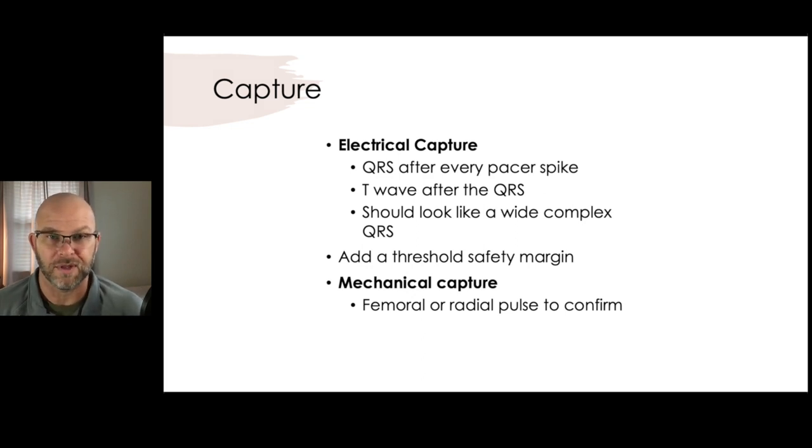We want to make sure we have capture. There are two forms: electrical capture and mechanical capture — mechanical capture matters more. Electrical capture means you have a QRS after every pacer spike, and more importantly, you want a T-wave, which helps differentiate from artifact because a T-wave represents repolarization. Once you confirm electrical capture, set your milliamps up just a little bit more to build in a safety margin. Threshold means the minimum energy at which you have capture; going up just a bit more above that gives you that safety margin.